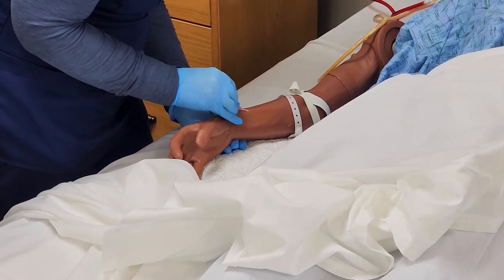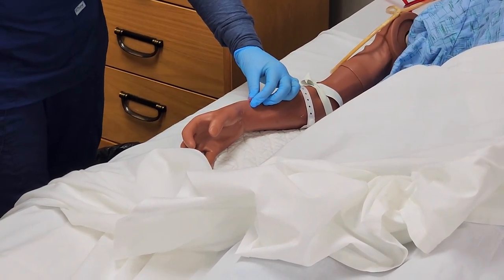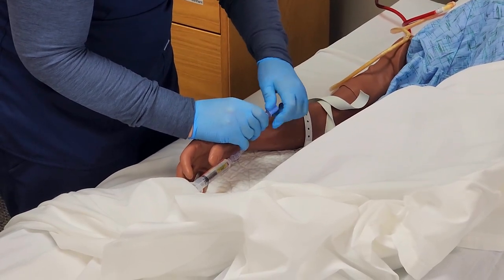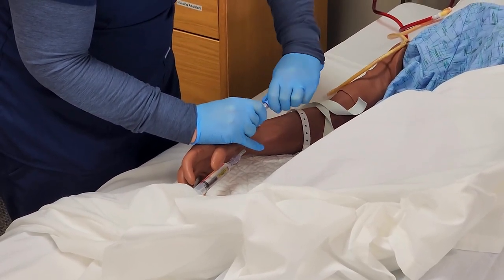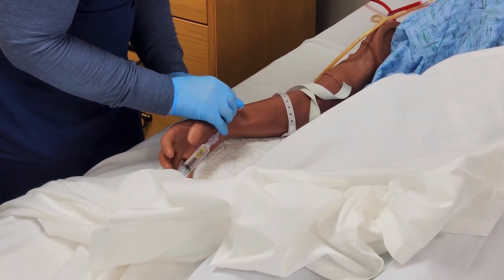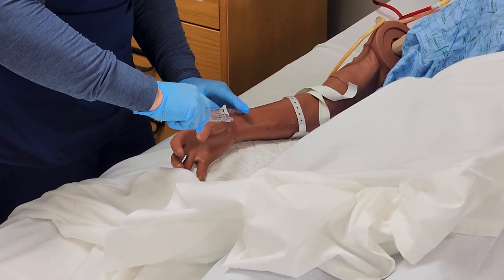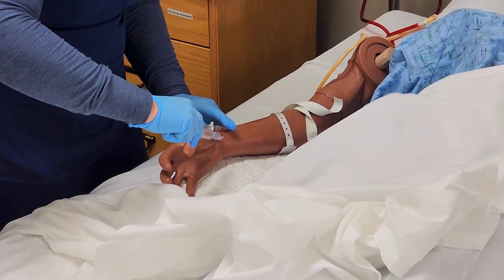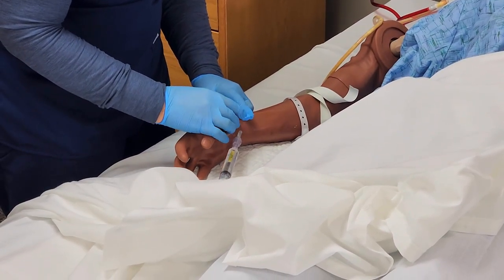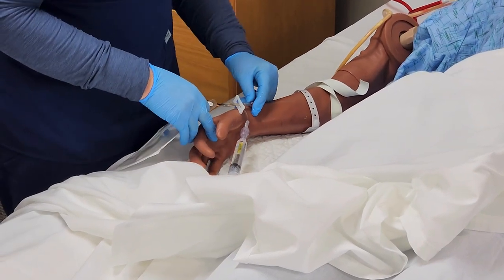Once you feel the puncture in the skin, go in a little bit more and try to even out the catheter. Then release the safety. Secure the IV, release the tourniquet. Confirm blood return and then flush with approximately three cc's of normal saline. Once flushed, clamp the IV and remind the patient to hold still.